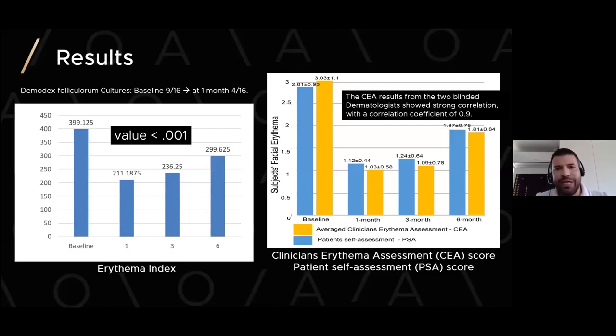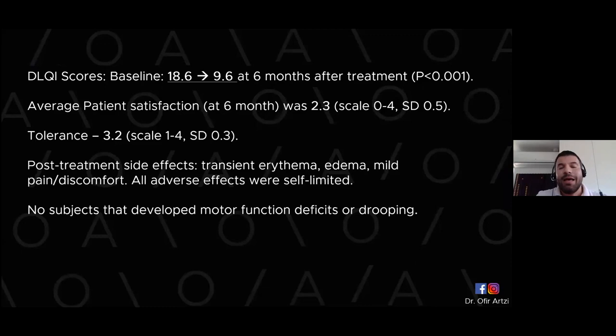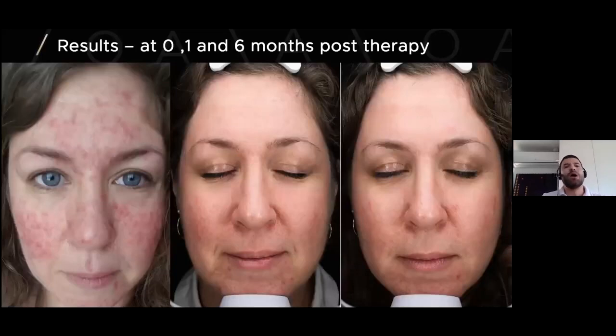If you look at both diagrams, we have very, I would say, red people. And then 1 month after 2 treatments, it is much improved. Then it gradually recurs, but it doesn't get back to the original state. It's very interesting, but 6 months after the last treatment, the Dermatological Life Quality Index was lower. You can see the before, at 1 month and at 6 months, and we have really many patients with this improvement. I cannot really explain why it works.